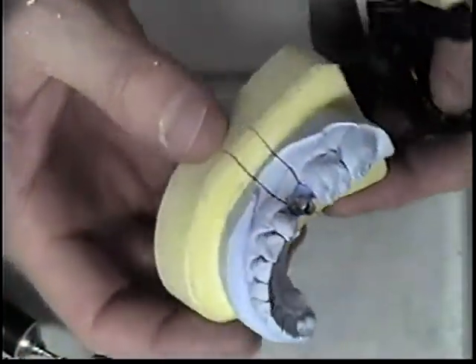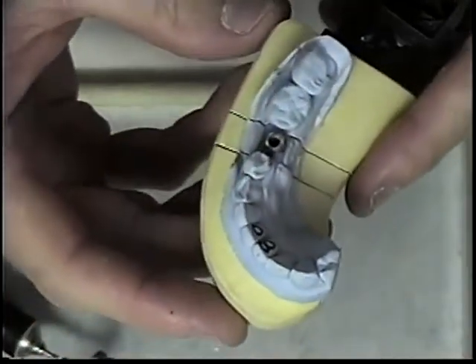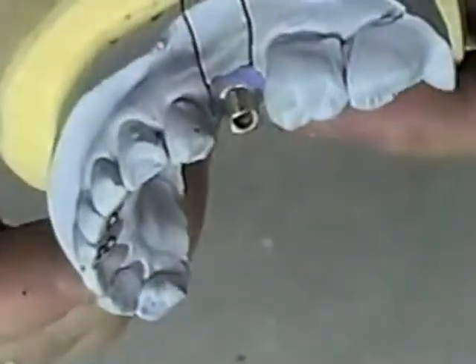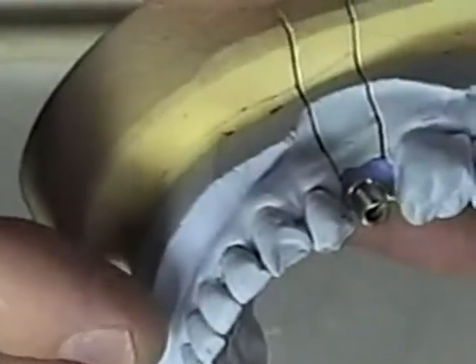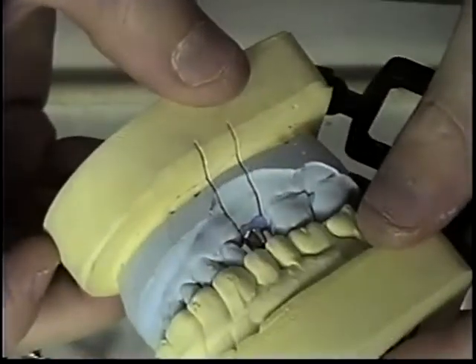I have made cusps also allowing for more retention. I can double check it. If I need to make any more modifications I can at this point, but overall it is pretty much where I want it to be. The margin has dropped below the gingival. I have adequate retention now and clearance so that I can build up a coping, then porcelain onto that coping.